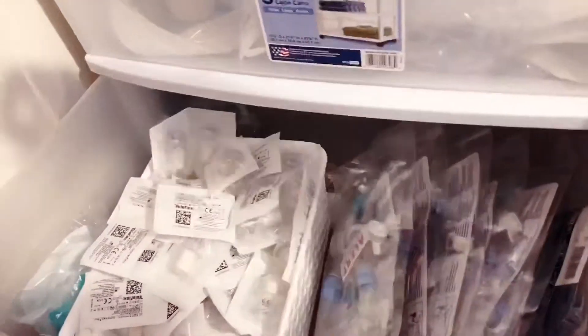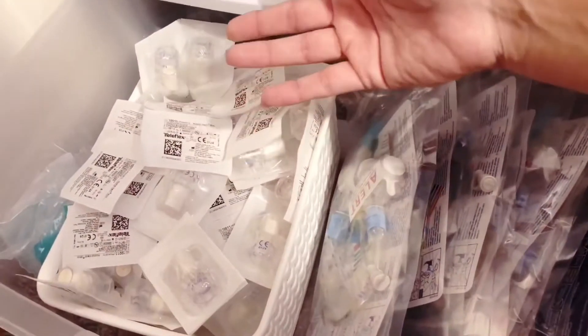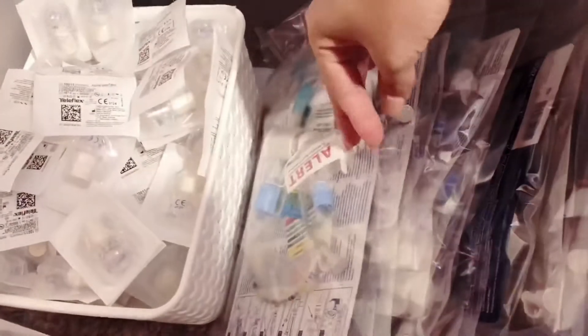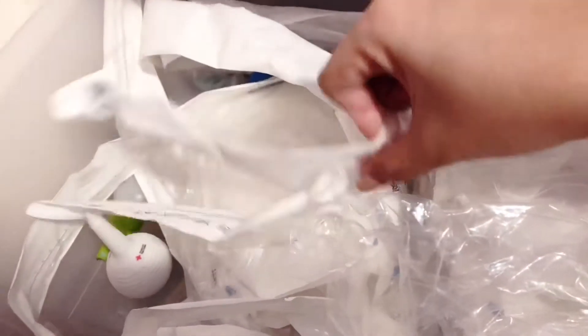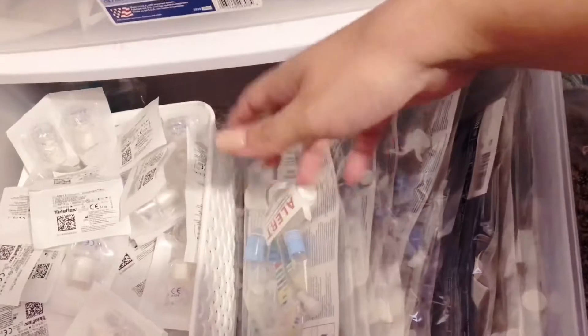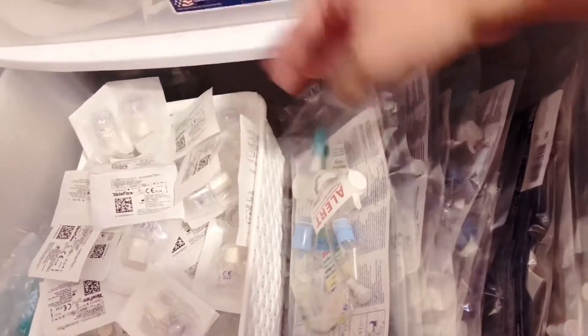The last drawer is for filters, inline suctions, and the HMEs. These are the HMEs — this is what Olivia wears when we go out, and now that she's not on the ventilator during the day anymore, this is what we put on her. I prefer the inline suctions over the open ones because once it's open it's not sterile. With inline suction, no germs get in and I don't have to remove the HME.